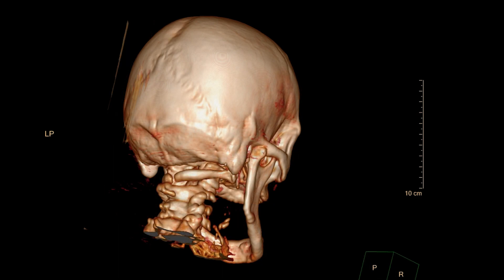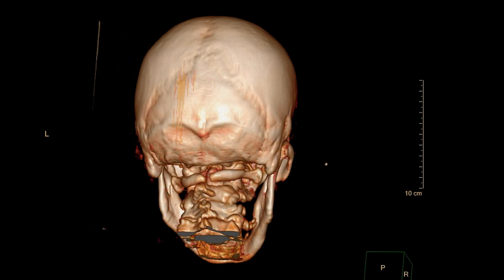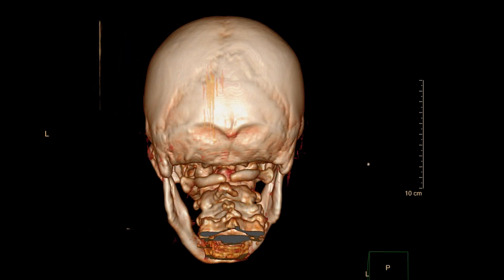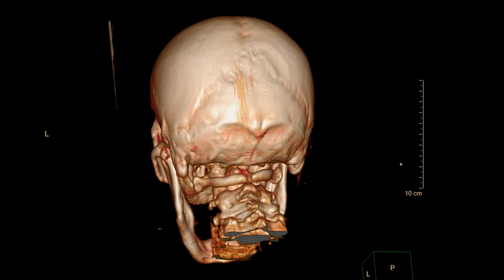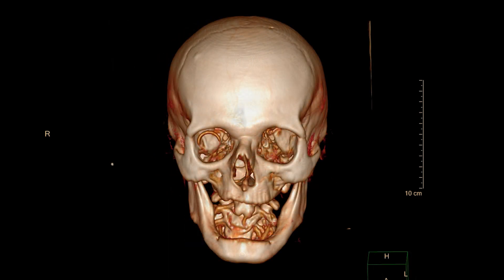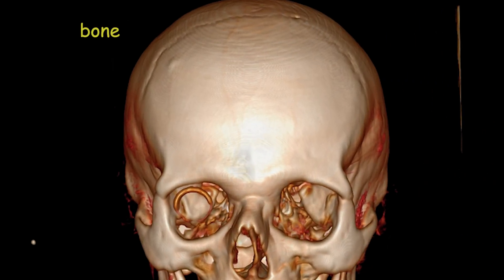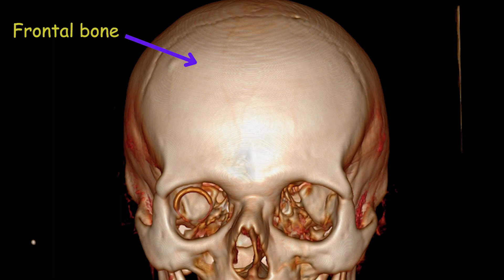In this video, you can observe images from different angles of the head in a 3D reconstructed CT scan. The frontal bone, located at the front and upper part of the cranium, is a significant component of the human skull.